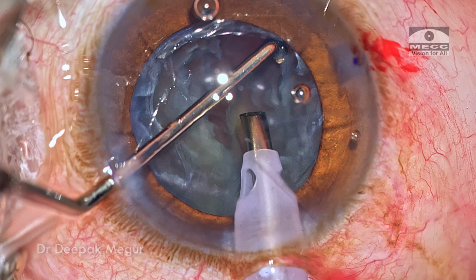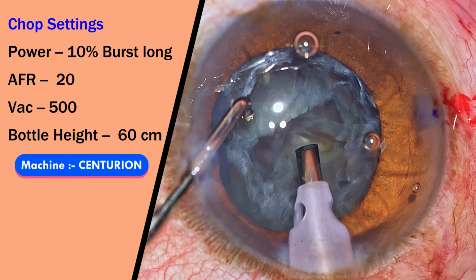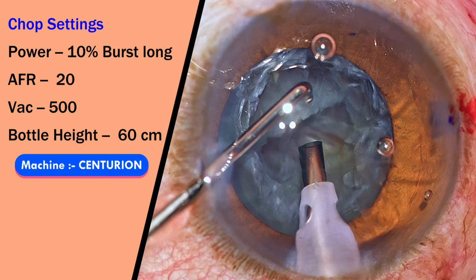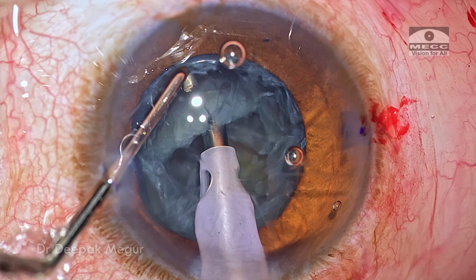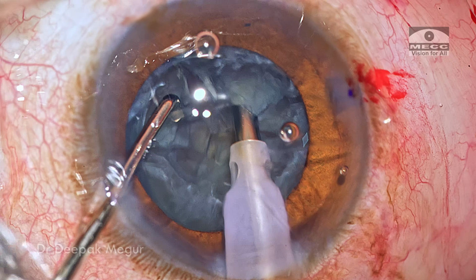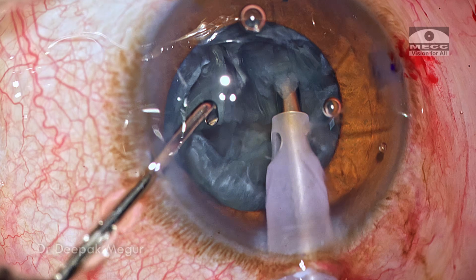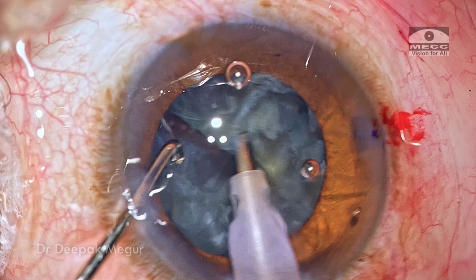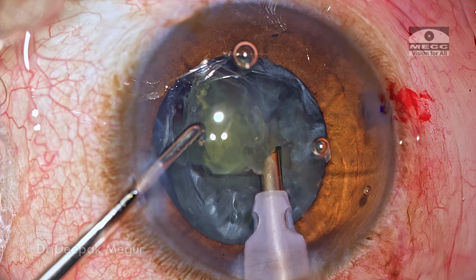The nucleus is quite soft and chopping it is going to be a challenge. So I change my settings to the chop mode, where I'm going to use only the longitudinal energy. The power is set at just 10% and still I'm finding it difficult to grip the nucleus. Nevertheless, the nucleus could be divided into two halves, and using the same longitudinal energy with very low power, I'm going to engage one of the fragments and pull it out of the bag.